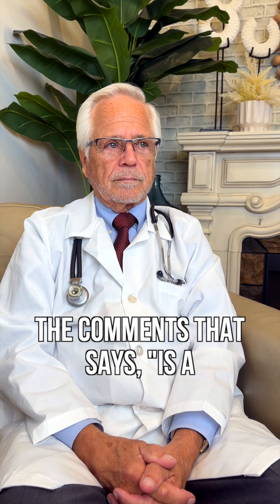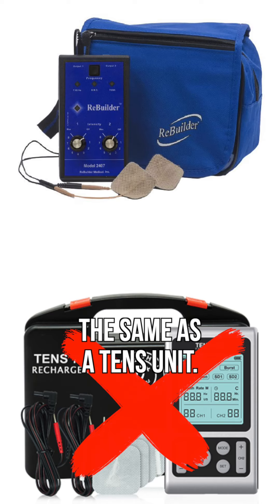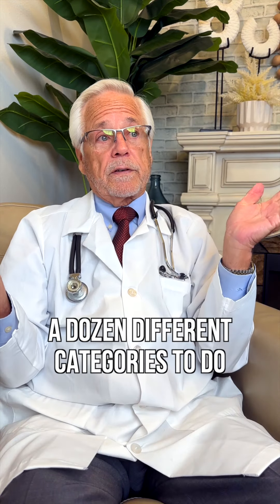Dr. Phillips, we got a question in the comments that says: is a Rebuilder the same as a TENS unit? The Rebuilder is not the same as a TENS unit. It was approved as a TENS under the TENS guidelines 28 years ago because there were only half a dozen different categories to do it, so we got it approved as a TENS device.